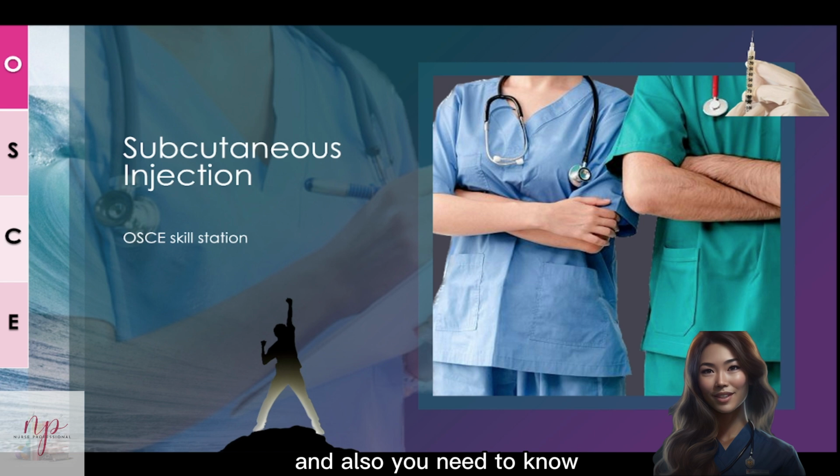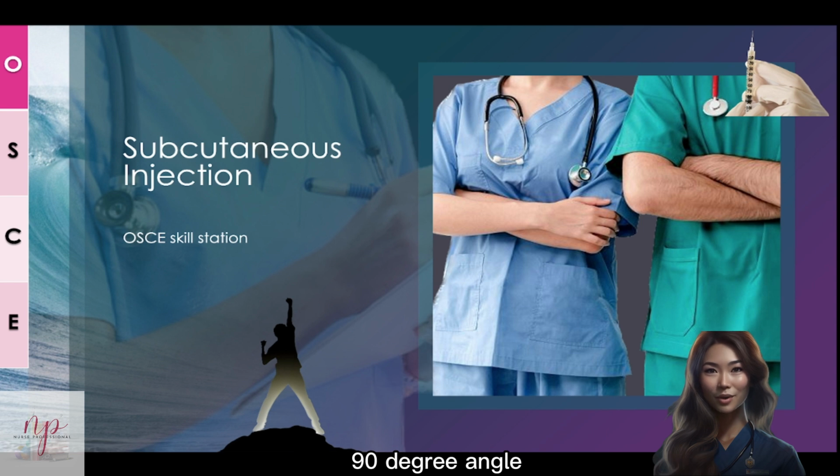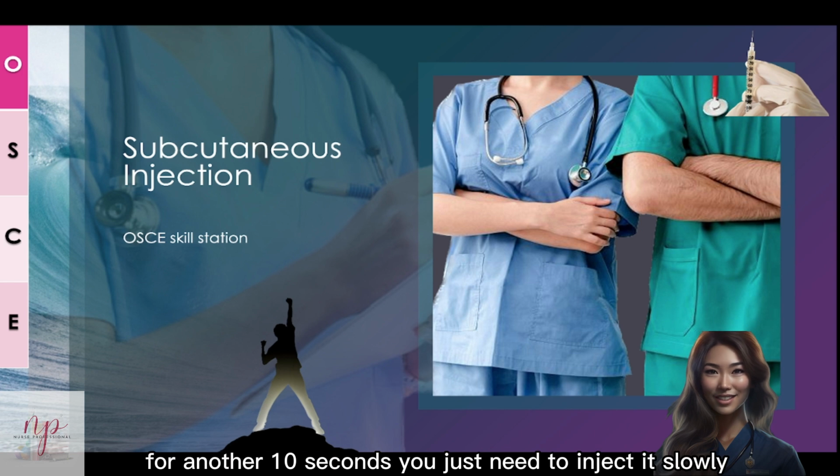And also, you need to know the angle that you are giving your medication. For insulin, 90-degree angle. For medication other than insulin, we give it at a 45 degree angle, okay? And also, you need to inject it slowly, 10 to 30 seconds. And you do not have to wait for another 10 seconds. You just need to inject it slowly.